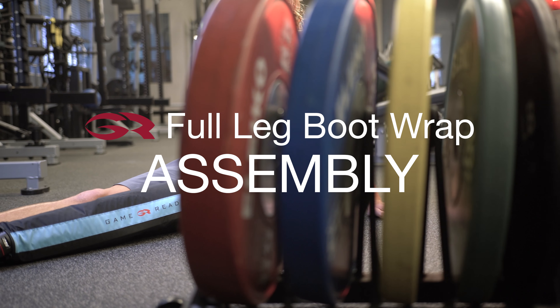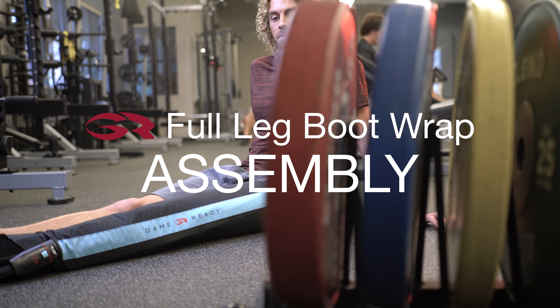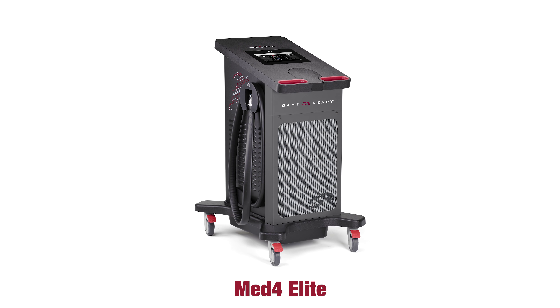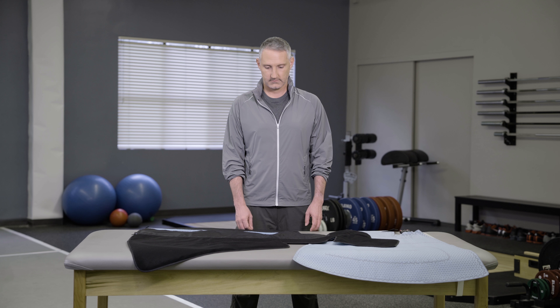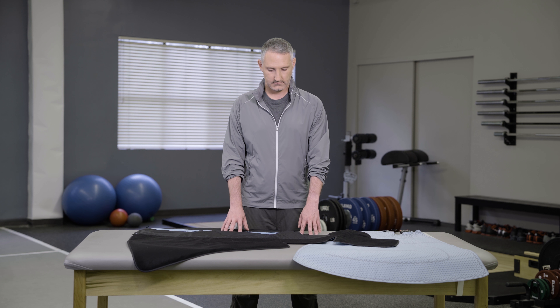Welcome to the GameReady Full Leg Boot Wrap assembly video. GameReady re-engineers recovery with leading technologies inspired by human endeavor, all designed to get people back to being their best after injury or surgery. This video will demonstrate how to assemble your full leg boot.